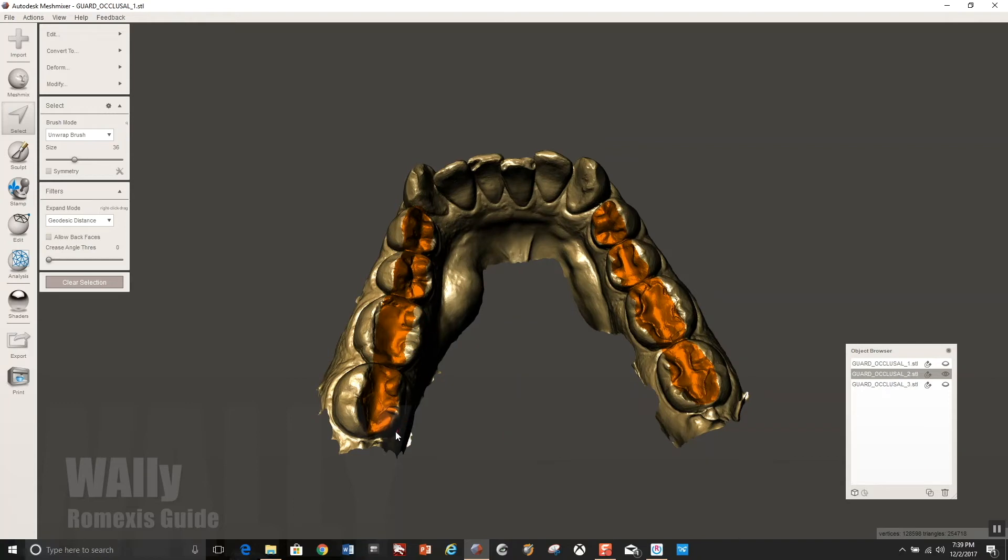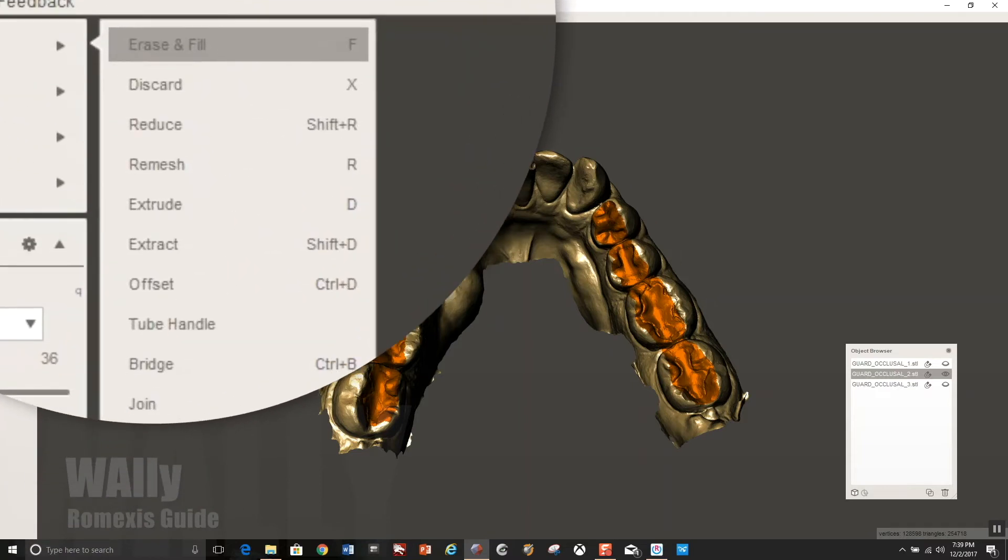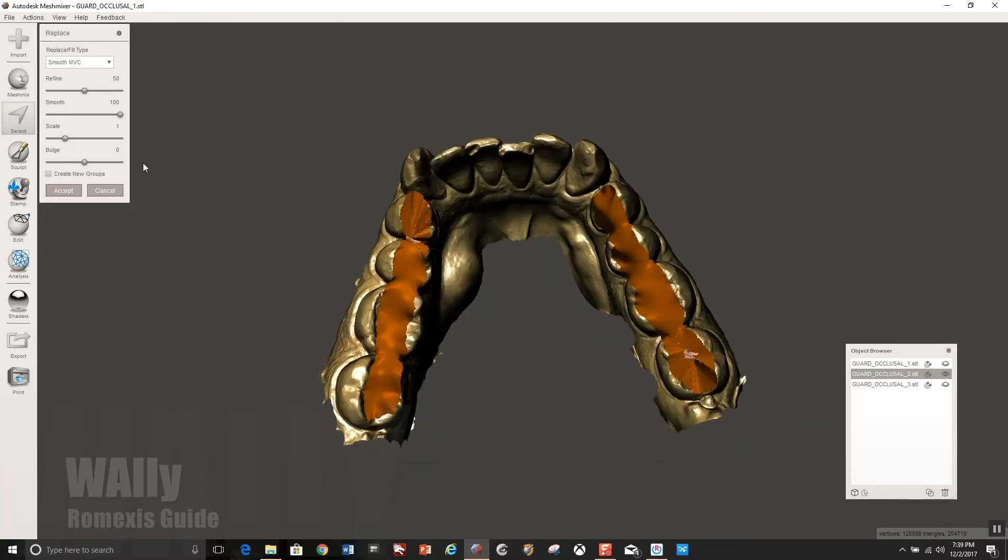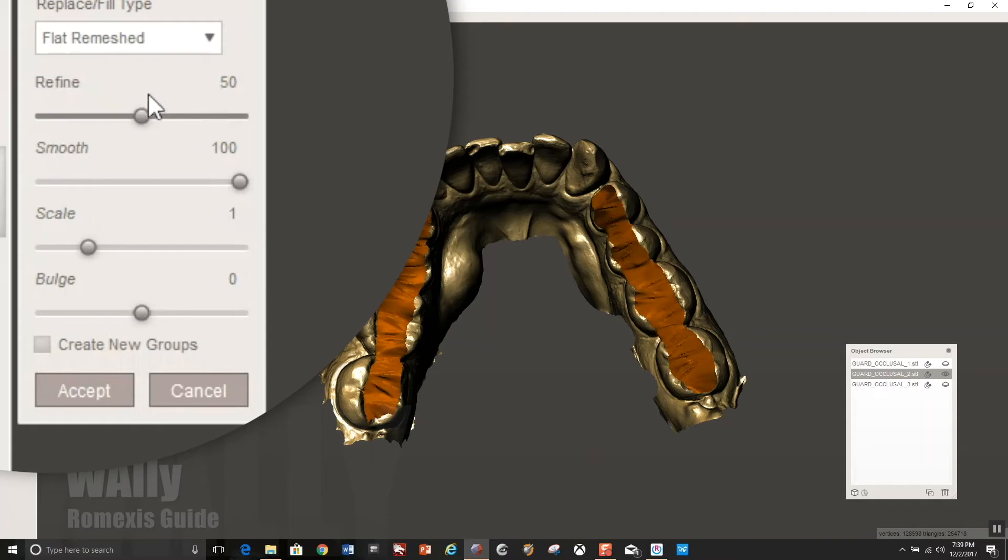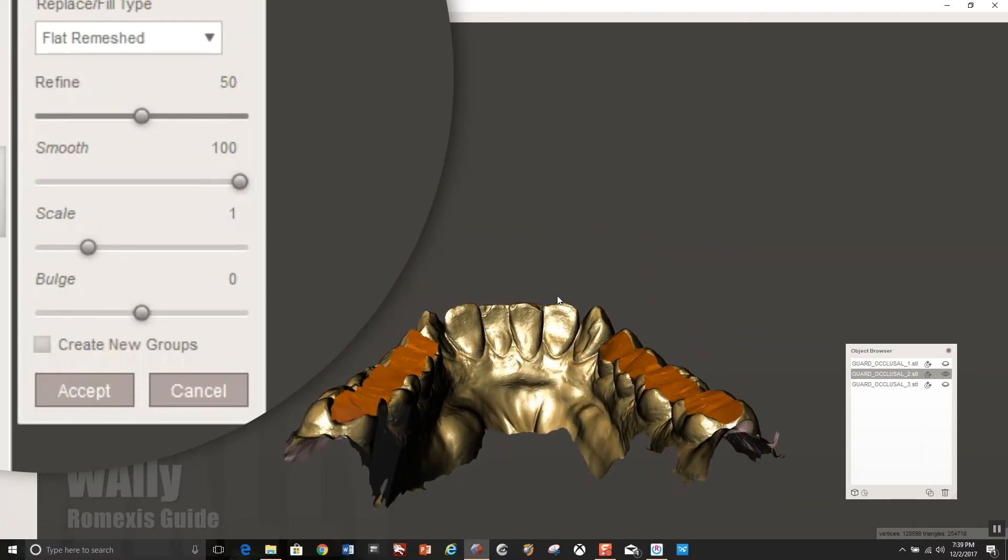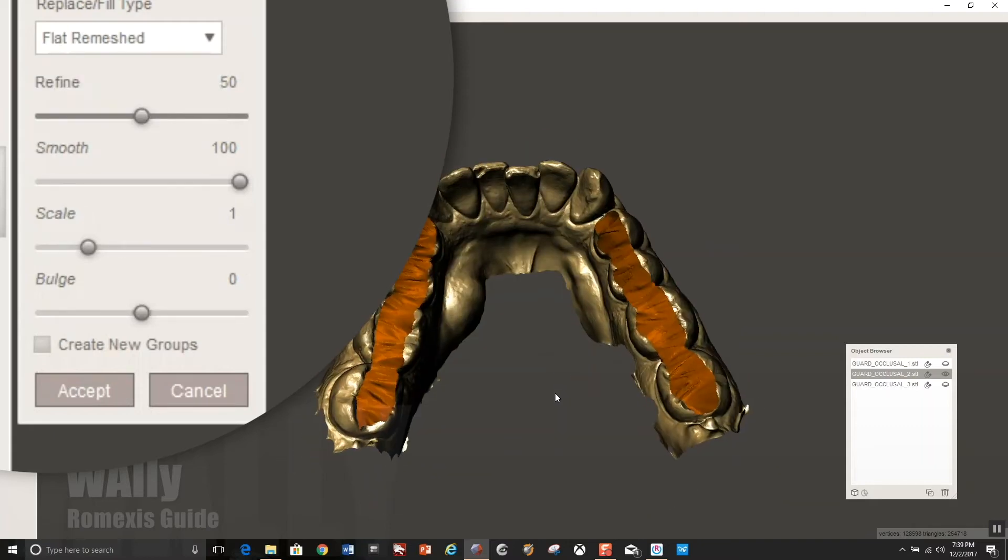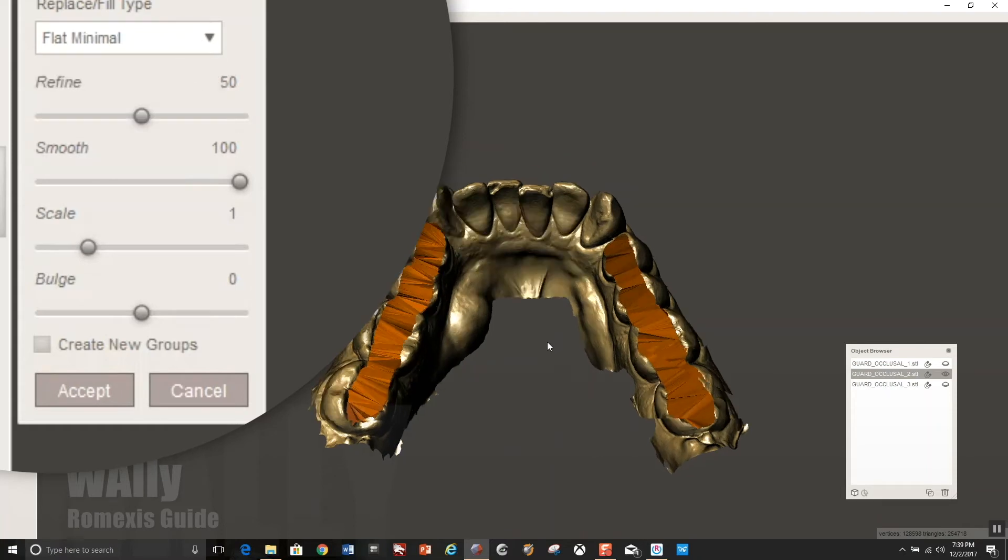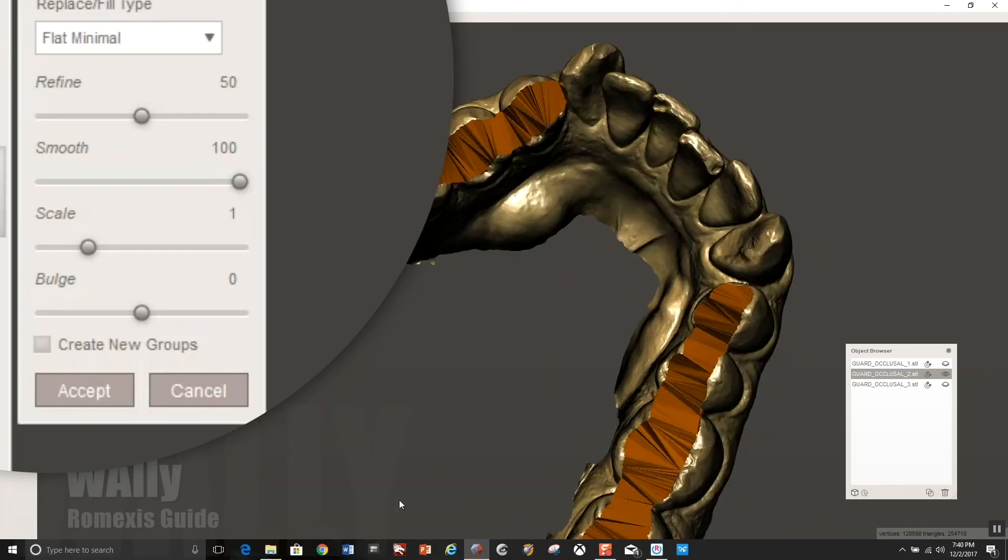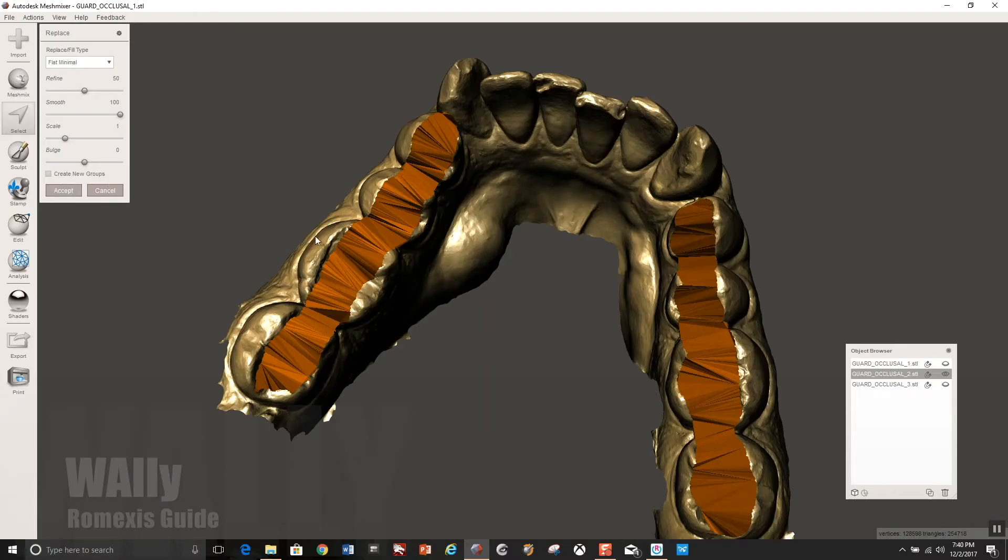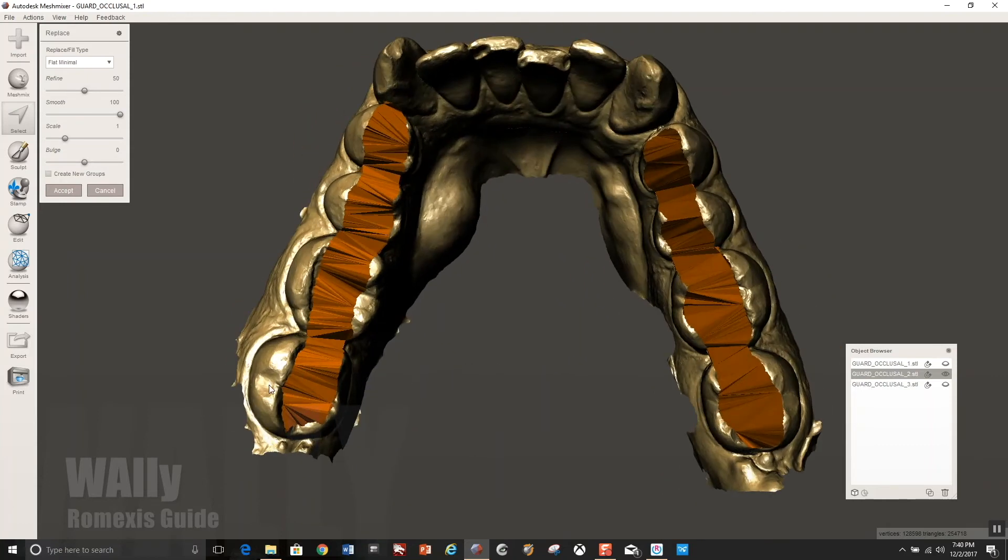Now control click to erase, like if you felt like you selected too far up the transverse ridge, you could hold control and click. But now you're going to go to erase and fill and you have several options when you erase and fill. I like to use the more simple rendering. I don't like the smooth kind of convex and you could alter how convex it is and concave. I like the flat minimal or flat remeshed better. And it's just going to create almost straight lines between the high points. So that's basically what I have here. And I want to probably go ahead and accept that and we could smooth it later.